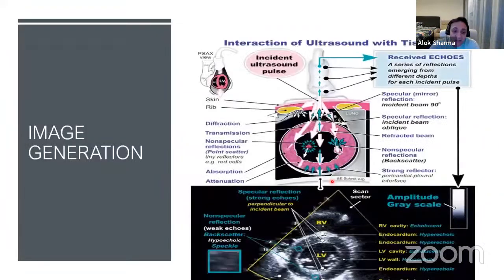In reality, actually, if you look at the heart, you've got the left ventricular cavity with blood inside, with papillary muscles, clearly with different areas of tissue depth and density. And really what is happening is you have issues, not just of reflection back, but you have reflection back at different angles from different surfaces. When you enter into the blood, you have different densities between the tissue in the left ventricle and the blood in the intraventricular cavity.